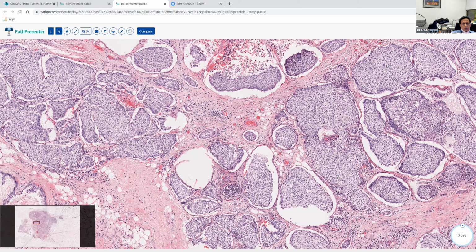In that study, of course, they said that these tend to be more aggressive, right? So what would be the analogous situation? It would be like low-grade DCIS versus high-grade DCIS, right? Something like that. So the authors, I don't think, were trying to make the point that high-grade encapsulated papillary carcinoma should be treated like invasive carcinoma. They were just trying to say that this is the high end of the spectrum.